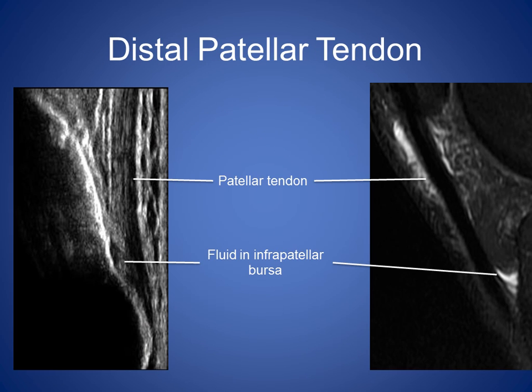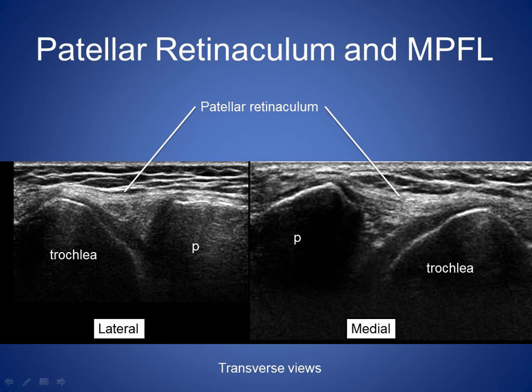Distally, the patellar tendon inserts on the tibial tuberosity, and you can often see fluid in the infrapatellar bursa, which can become inflamed and can be a cause of pain. You swing medially and laterally, you can see the hyperechoic patellar retinaculum and the MPFL.